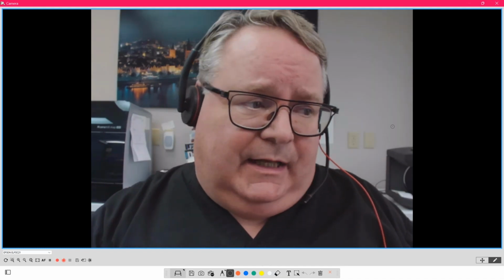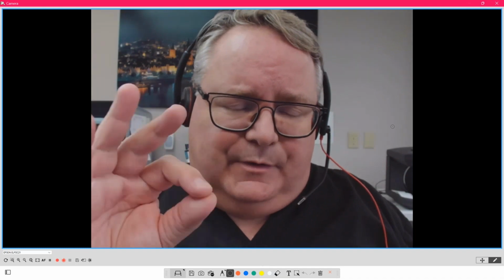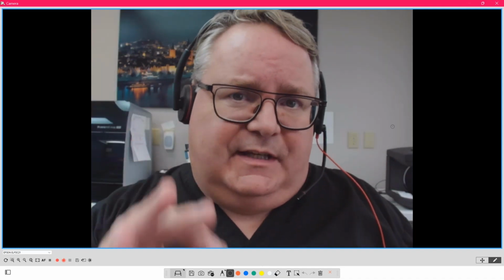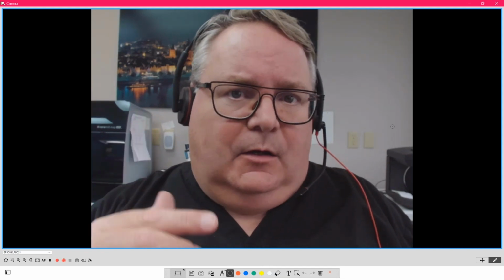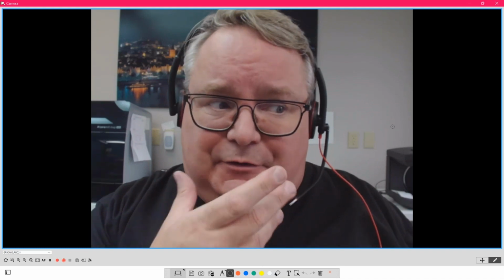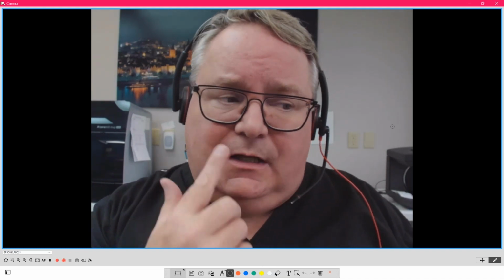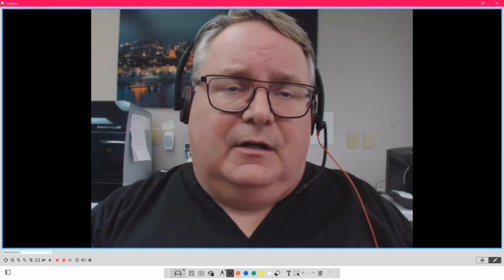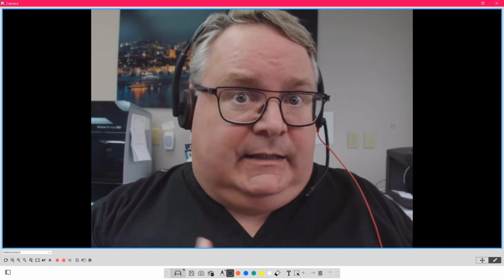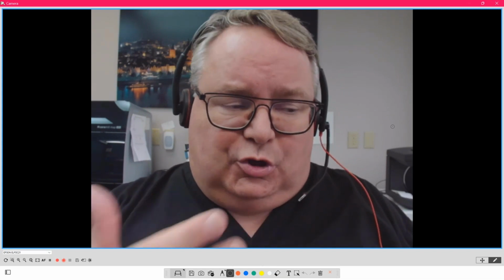Thank you, Jim. And to Jim's point, when we change something, you must remember that there's no nerve in the denture or the denture teeth for the patient to feel. But the central nervous system will understand that there is a change because their tongue is feeling it. Their tongue now has to go to a different position. Their lips are in a different position from the changes we made from the new denture. And it can take time for the central nervous system to learn those changes.